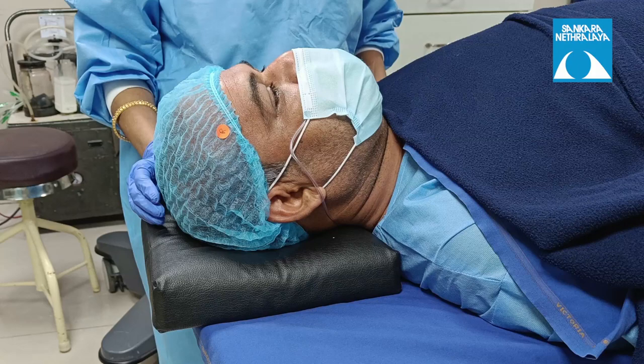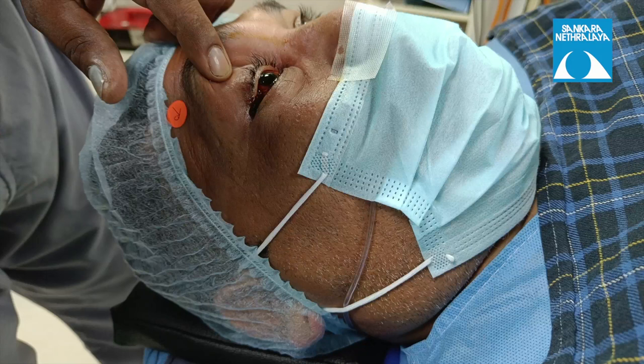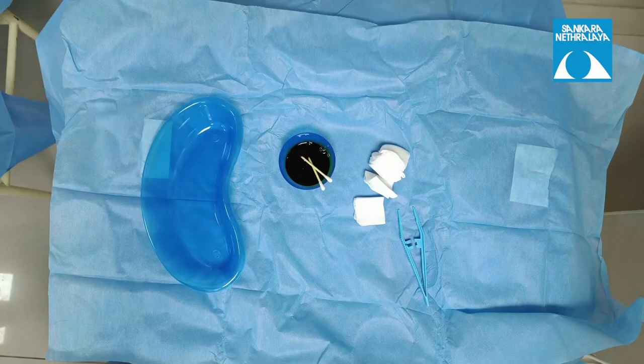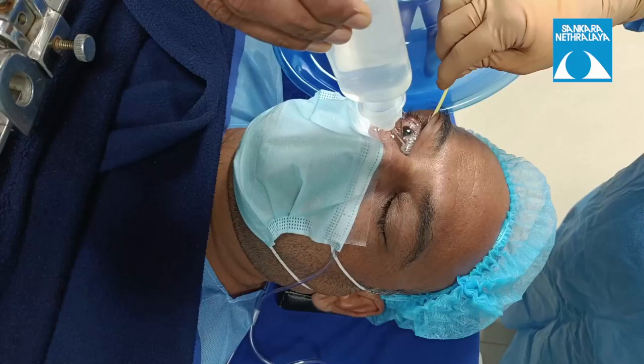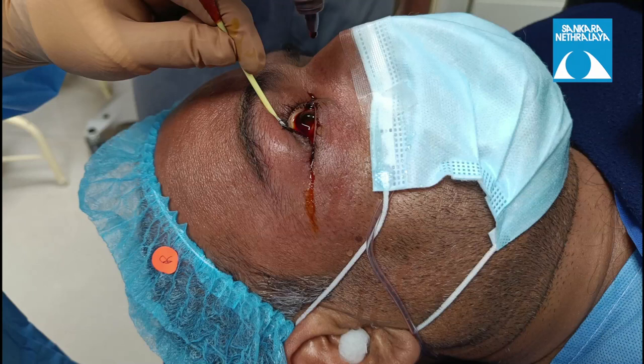Once the anesthetist blocks the eye, always cross-check for ocular movements and then instill povidone iodine eye drops before proceeding with cleaning. The sterile cleaning kit is then opened on the trolley with a sterile sheet, and an eye wash is given with 100 ml of sterile normal saline to clean the fornices, followed by installation of povidone iodine eye drops again.